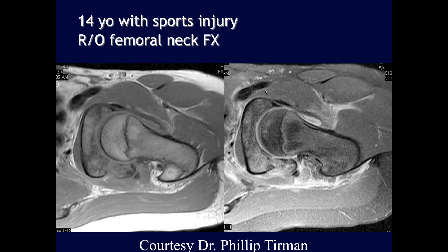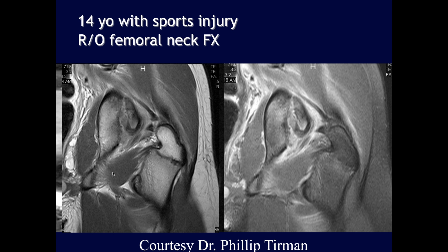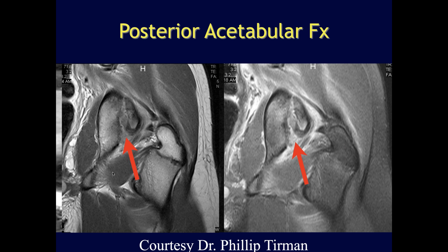A 14-year-old with a sports injury presenting to rule out femoral neck fracture — the femoral neck is intact. However, there is a posterior rim fracture of the acetabulum with extensive edema throughout the acetabulum, and additional fracture lines extending through the acetabular rim. A large fragment appears completely detached and distracted.